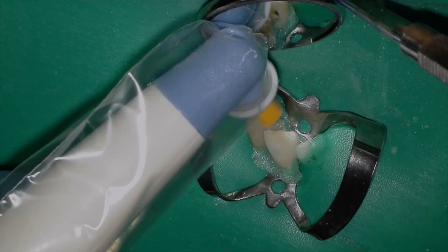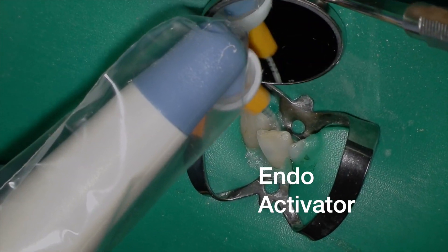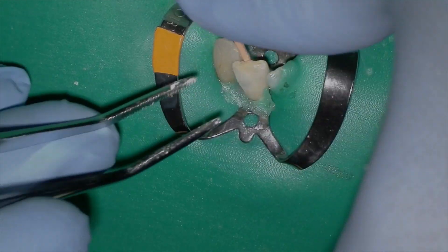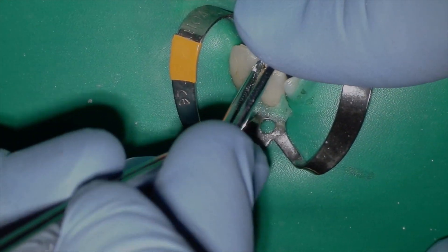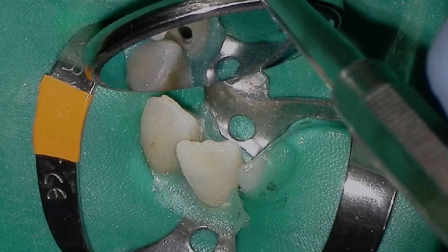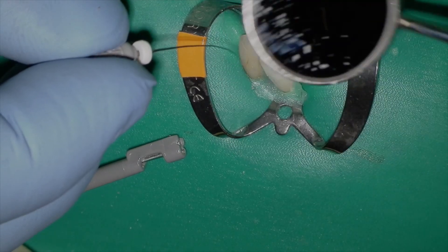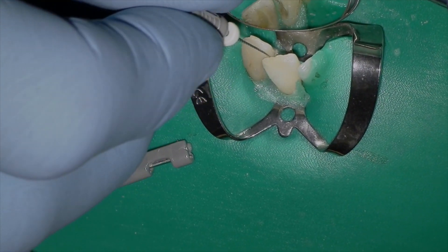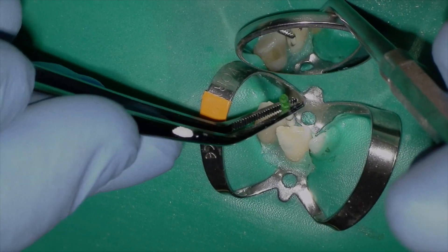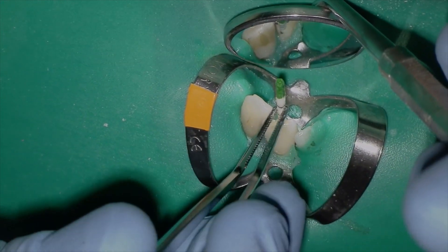Irrigate, irrigate, and more irrigation. We're going to activate our irrigant with our Endo Activator. We're going to fit our gutta-percha point. We troughed and I can't see another canal. Let's do one more look with a curved file to try to engage anything of that canal lingually — I'll place the file in, rotate it lingually, and see if I can catch a snag. I wasn't able to find any other canal in this tooth.